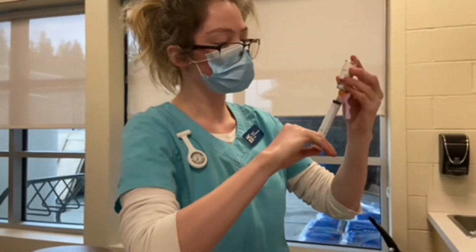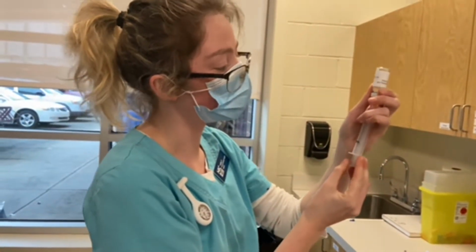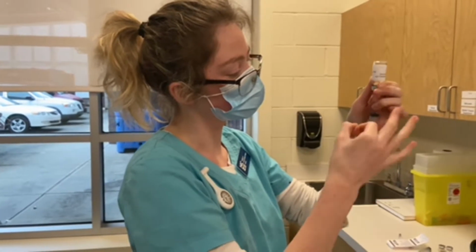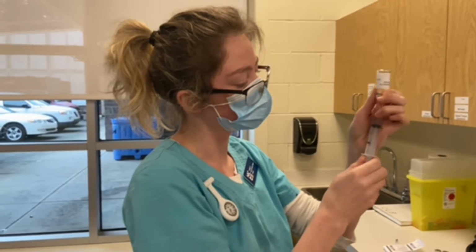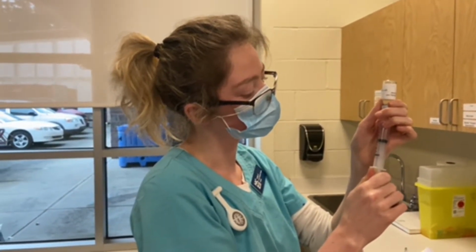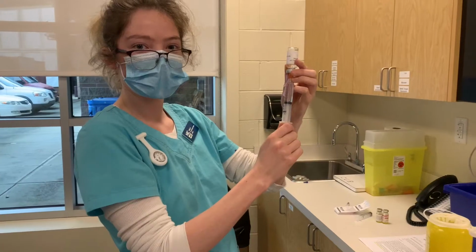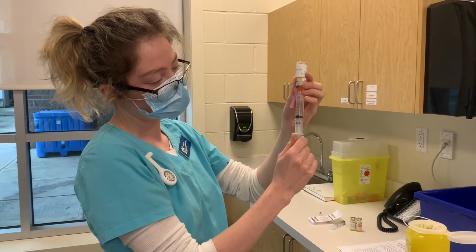Now I invert and draw back 8 ml of sterile water. And now we're going to continue with our sterile water drawing.